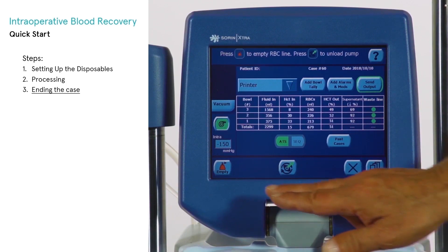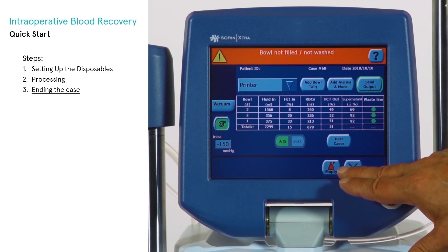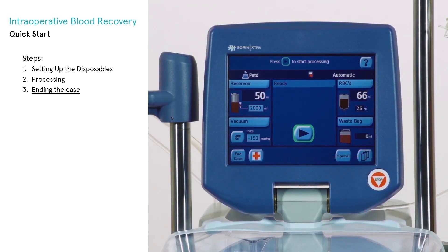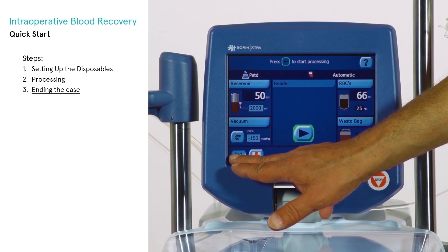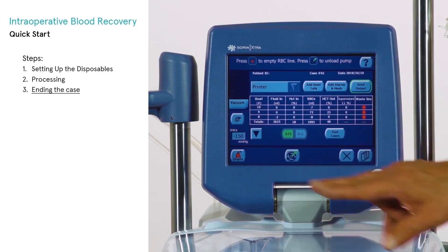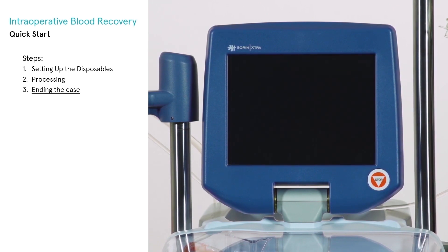From the end case screen, the operator may empty the RBC line, export case tally data, and unload the pump loop, which allows for the teardown of disposables. The machine can then be powered off.